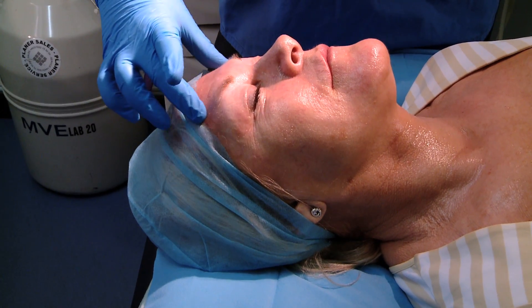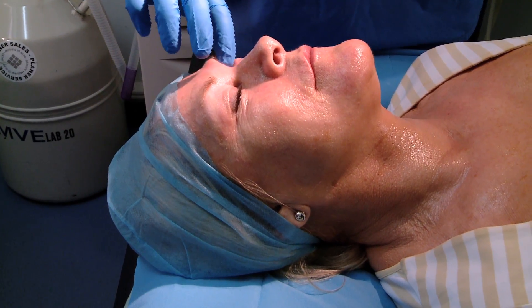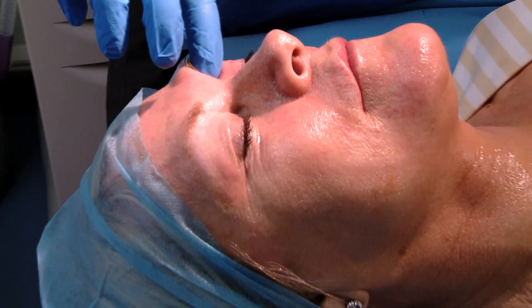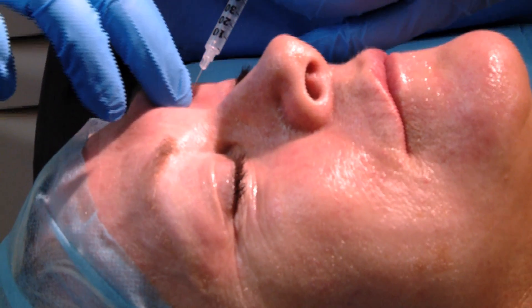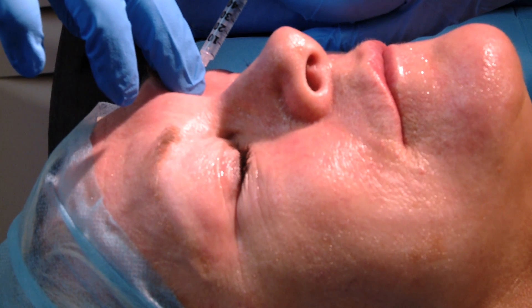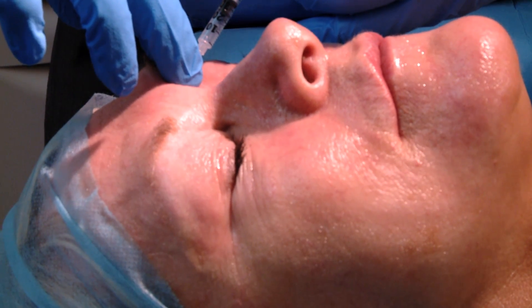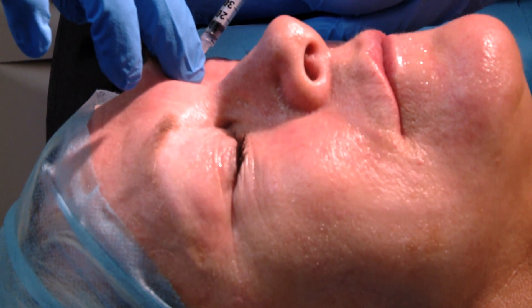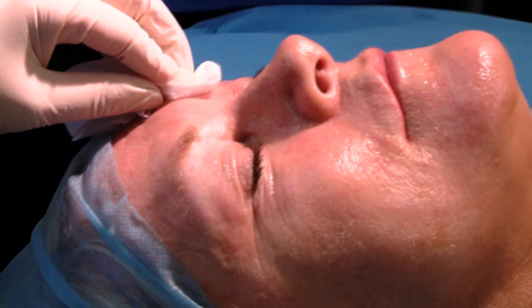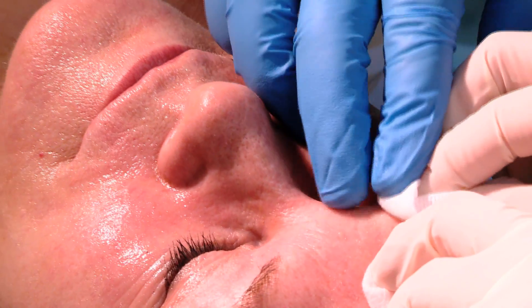The supraorbital nerve, which covers most of the frontalis except for the lateral aspect, can be accessed through the little foramen just sitting there. Sometimes it's easier if a staff member holds the area, but I can manage alone. We hold the needle in, pointing towards the medial aspect, maybe a third or a quarter of the way down — this gives a very effective frontalis block for up to 40 minutes.